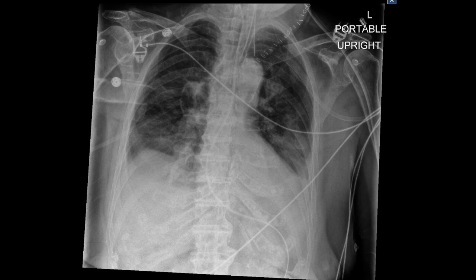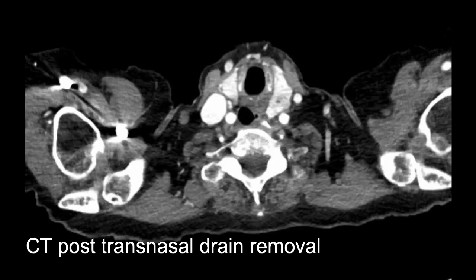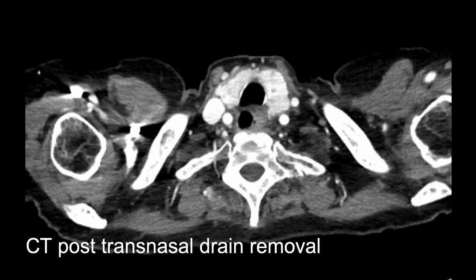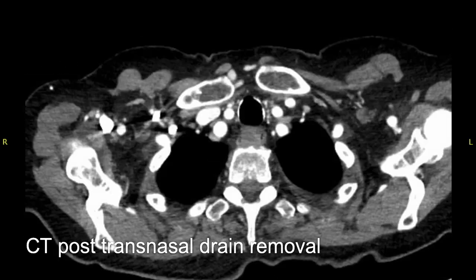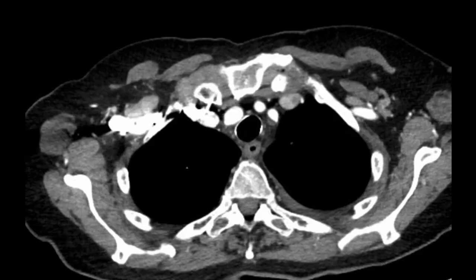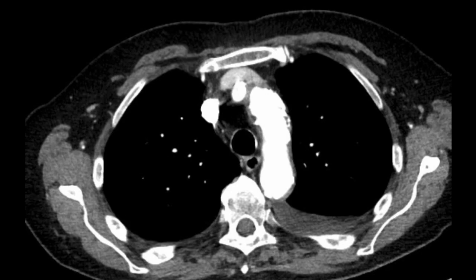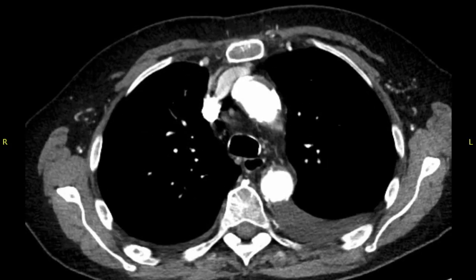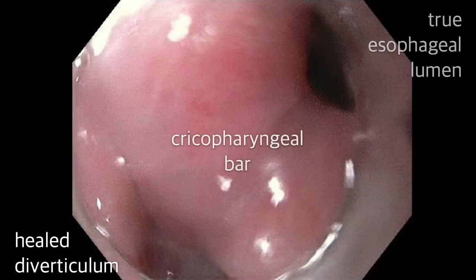Nutrition was given by a percutaneous gastrostomy through the course of her hospital stay. She was tolerating clear fluids prior to discharge. She was followed endoscopically as an outpatient, and the drain was removed under endoscopic guidance at 8 weeks following surgery. CT confirmed resolution of the mediastinal abscess.